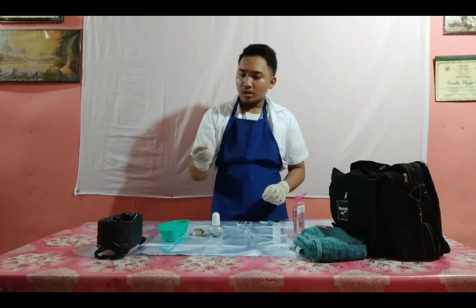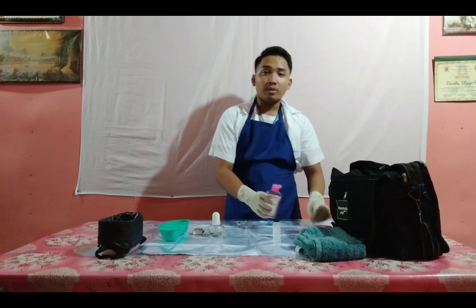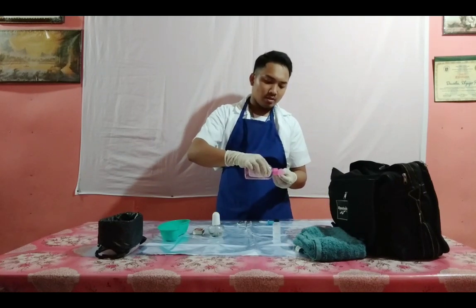Now I will place this first cotton ball in the waste receptacle because it is already contaminated.